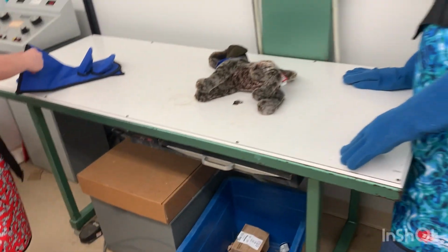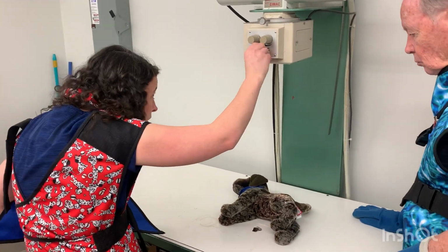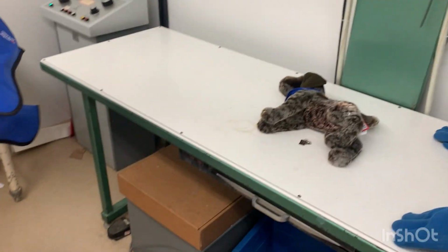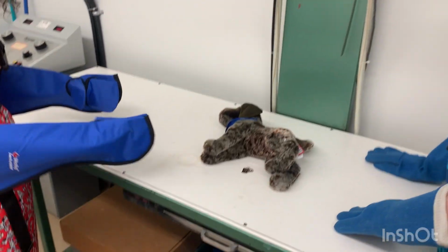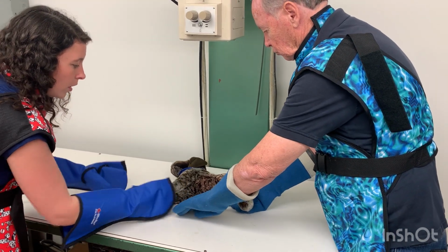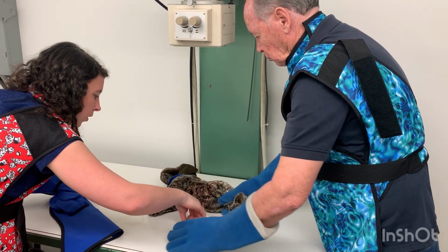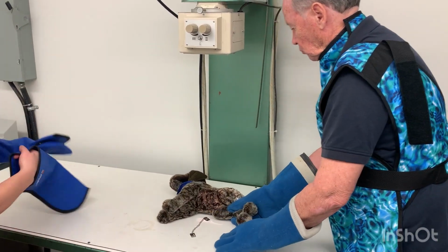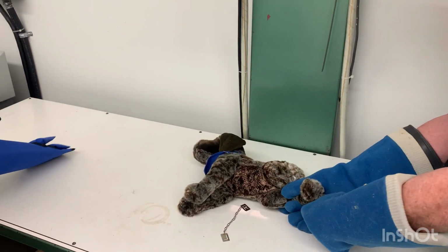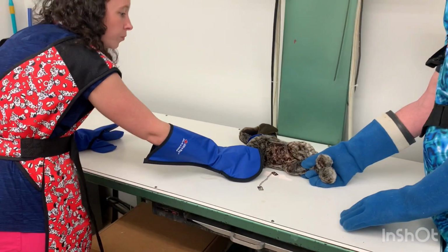And then what we're going to do is we're going to put our gloves on. Making sure this is on here, which it is. And now I'm going to ask my assistant, we need to pull the legs back, please. So we're going to pull the legs towards you caudally, and I'll pull this part right here. And we just want the R to be exposed. Yeah, here we go. That'll work. And we want to make sure too that the spine here is going to be nice and straight. So our spinal processes will be all in line with each other, all parallel. So that would be pretty good.